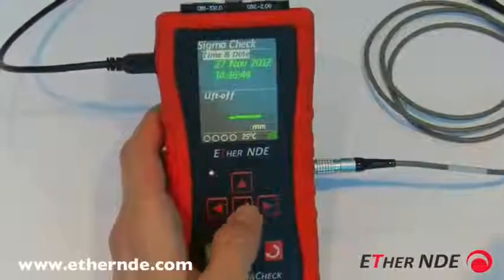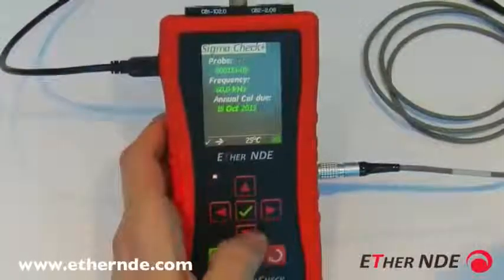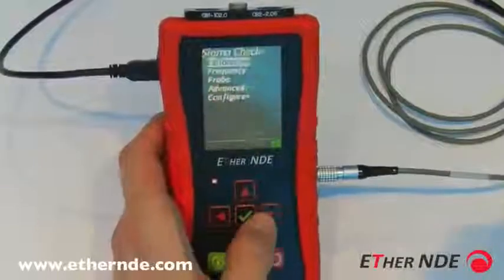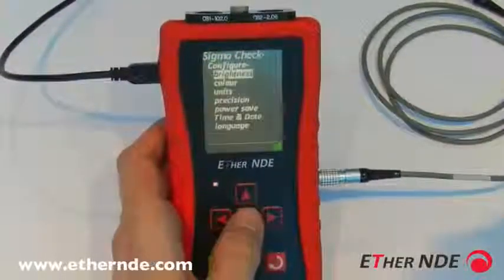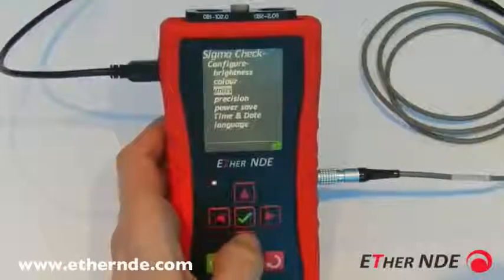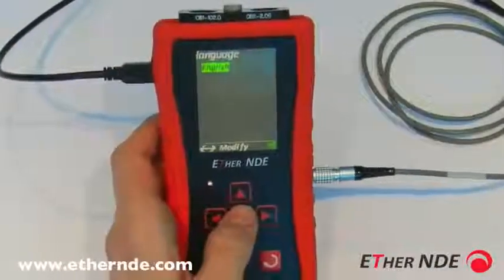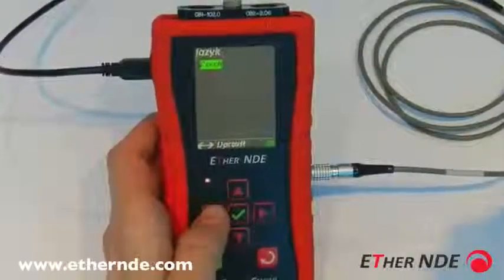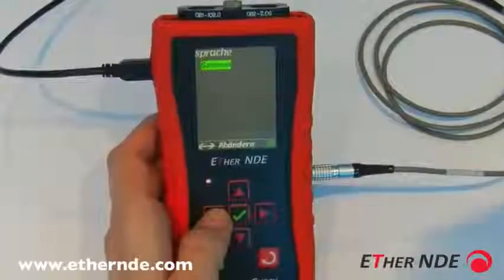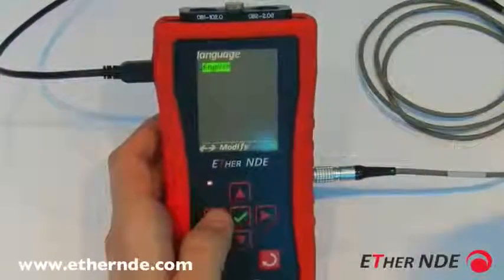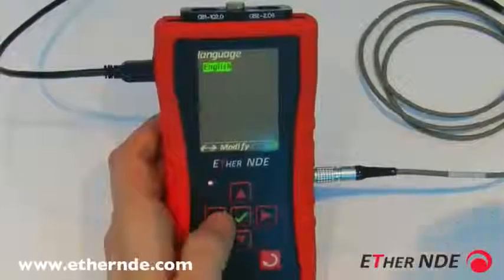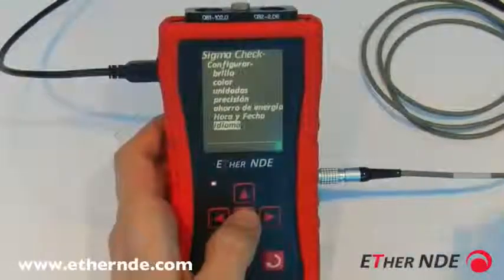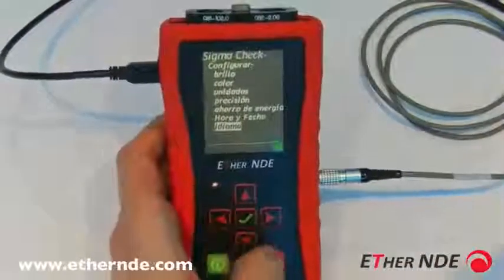Finally, configuring the language of the Sigma Check: the Sigma Check can be displayed in various languages. Expand the Sigma Check menu, down to configure, and then down to language. Currently highlighted is English. Using left and right you can scroll through all available languages into which the Sigma Check has been translated. For example, let's pick Spanish.